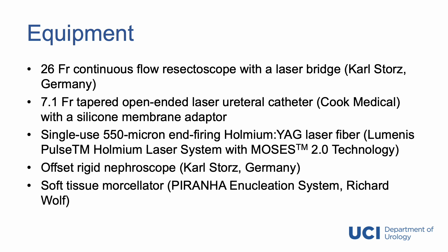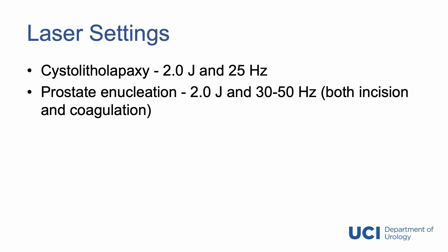For morcellation, we use an offset rigid nephroscope and a soft tissue morcellator from Richard Wolf. For laser settings, we utilize 2 joules and 25 hertz for cystolithopaxi and 2 joules and 30-50 hertz for prostate enucleation. This is what the MOSES setting activated.